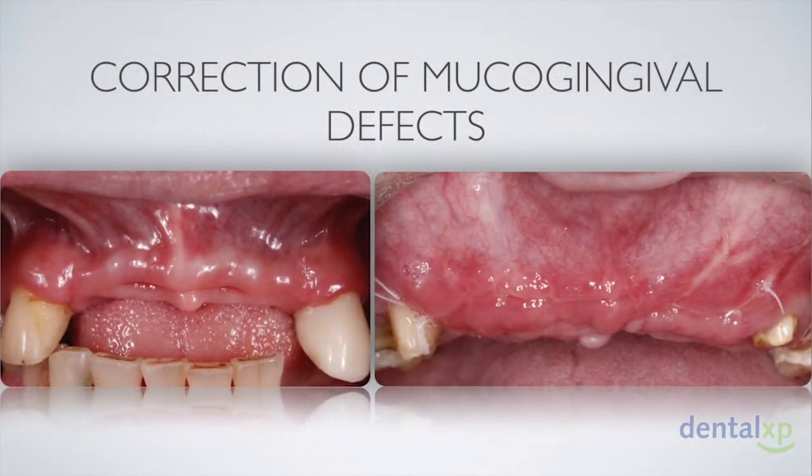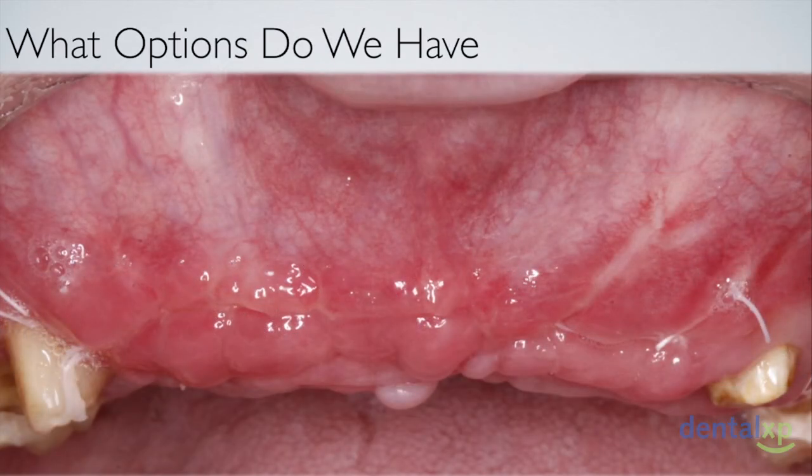And going back to one of the downsides of extensive bone augmentations, the question is, how do we manage this vestibular depth reduction and lack of keratinized tissue in the area? So let's look at the available options.